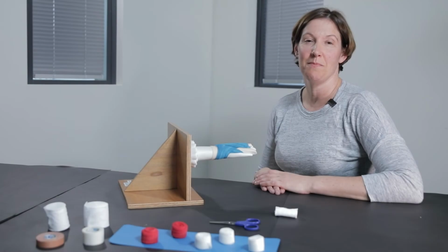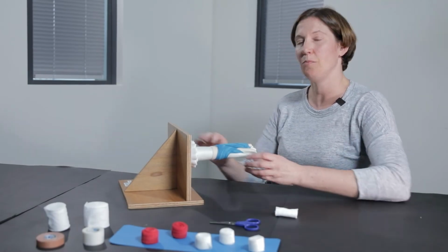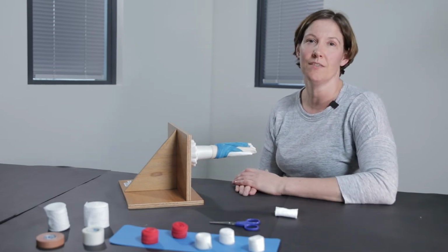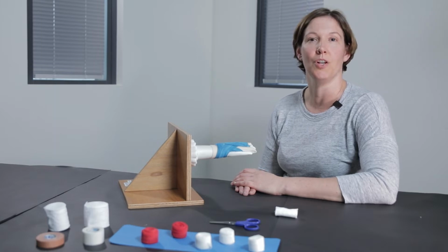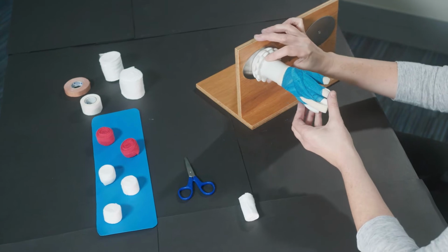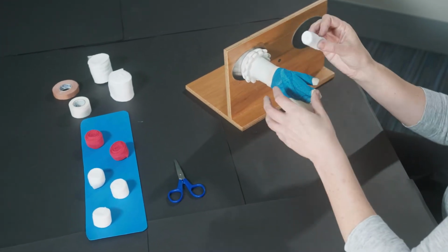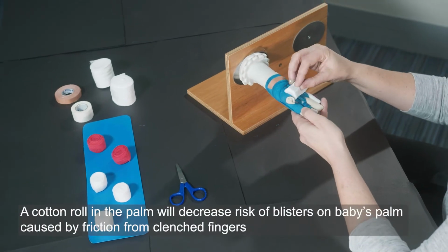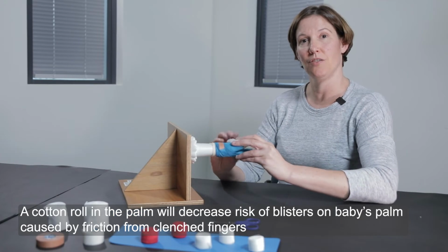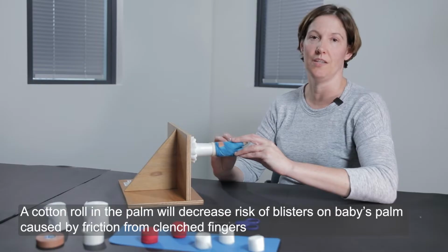Now I'm going to share some strategies with you for wrapping a newborn's hand. Newborns' hands can be particularly challenging because of their size and because of the natural reflex of the hand to want to close and stay clenched. So one of the strategies is using just a soft cotton roll and placing that just in the palm of the hand. What that can do, firstly, is to try and minimize any more trauma to the hand when there aren't any dressings in place.